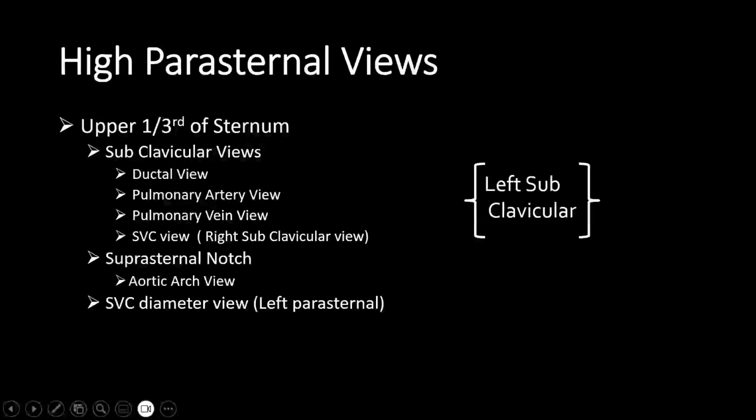low parasternal views. So till now, what we have discussed are apical views, in which we have two sweeps: when the foot of the probe is swept anteriorly, we get apical 5-chamber view, and then we sweep the probe more anteriorly, we go to apical 6-chamber or pulmonary artery. Then we come to the low parasternal views. First is parasternal long axis. We have two sweeps in that: sweep downwards, towards the foot, is tricuspid valve or RV inflow sweep, and sweep up towards the head is your pulmonary artery or RV outflow sweep.